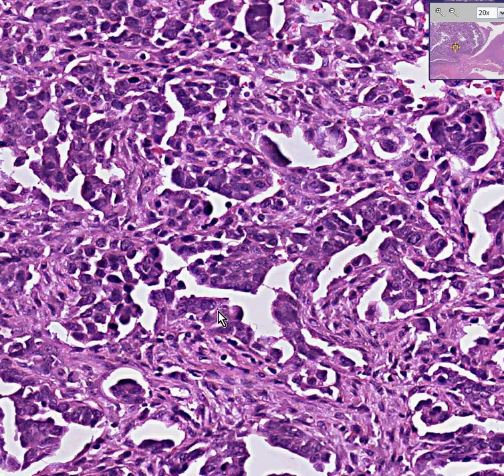Here are epithelial cells. Here is fibrous tissue. Here is fibrous tissue. Here are epithelial cells. Here's probably a single epithelial cell. You could notice the striking difference right away.